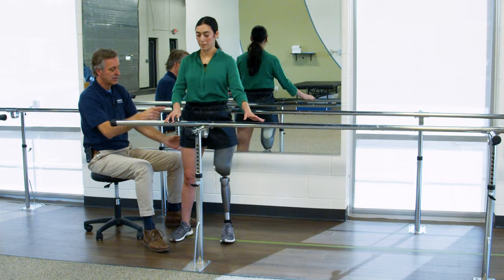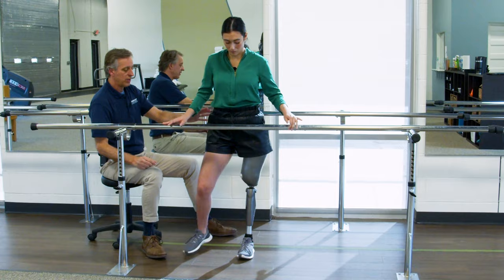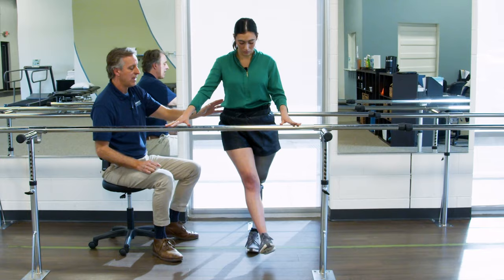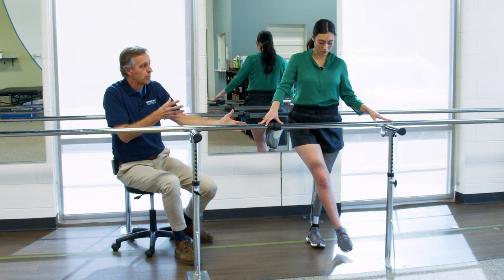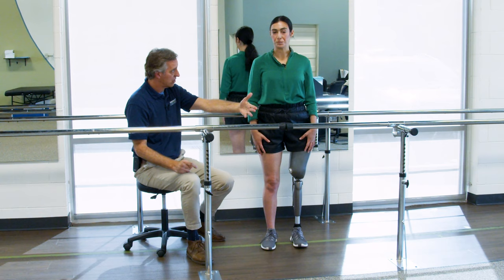Step out, lift up, hold that balance for a second, then choose to go around behind it. All right, up, hold, and then go around it. Good. Step, up, hold, and then go behind it. All right, that's a little bit higher skill, but it's teaching Tracy, even from an awkward position, I can still find a home with balance and then I can rotate around it and recapture my balance control.